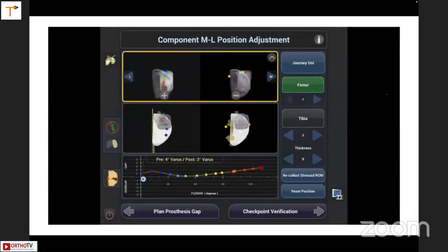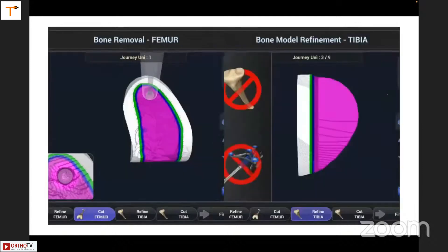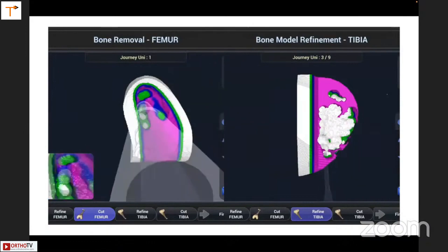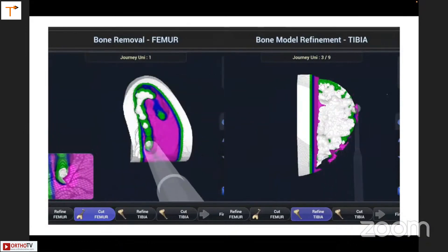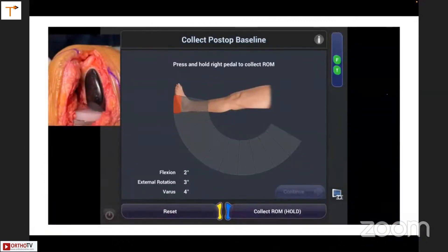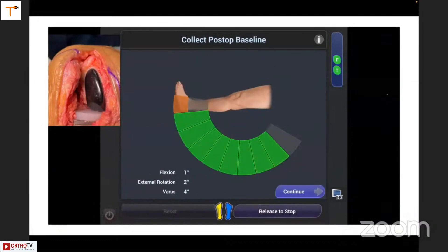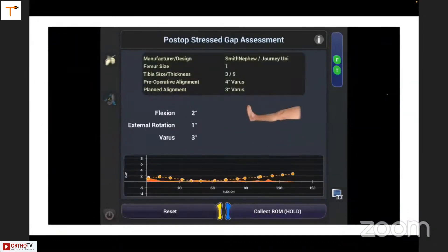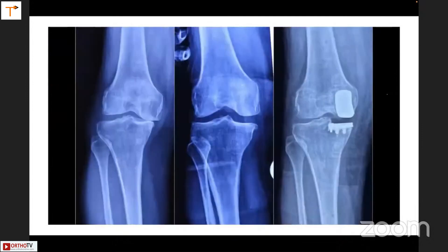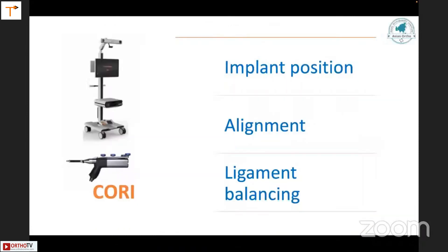Check the femoral tracking — look at the posterior femoral contact dots. With the handheld robotic burr, you keep perpendicular to the cutting zone and it performs beautifully — can be done in one to two minutes. Get the range of motion and post-op kinematics, restoring the joint line very clearly. Implant position, alignment, and ligament balancing — all these are addressed with robotic assistance.